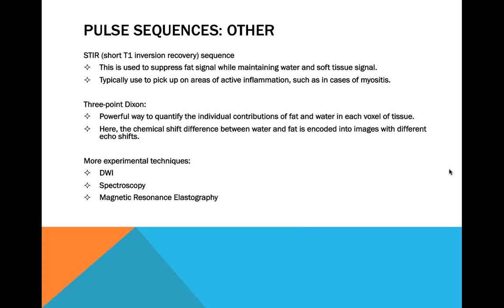So because of that, additional efforts are being made to come up with other sequences that could kind of give you a clear idea of what's fat, what's water, and kind of be able to quantify those, mainly in an effort to be able to follow these changes over time and use them as a reflection of response to therapy.